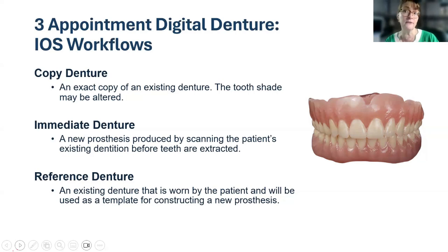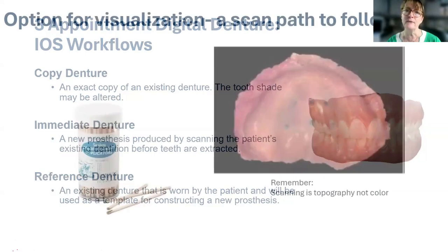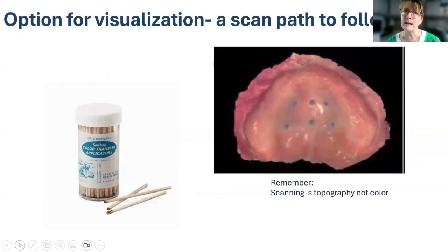Aesthetically, the patient's not happy with it. I was like, does it fit well enough? Does it fit as good as a custom tray? Oh, well, yeah, sure. Well, then we're going to use it as a custom tray. And we'll get into that.